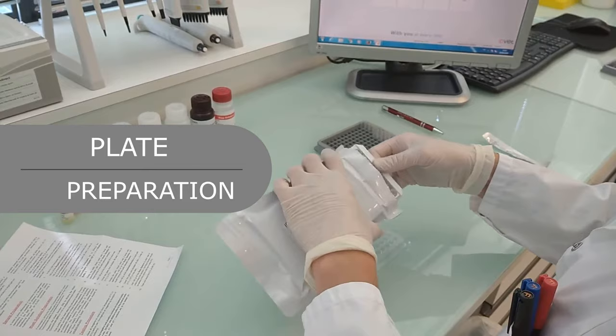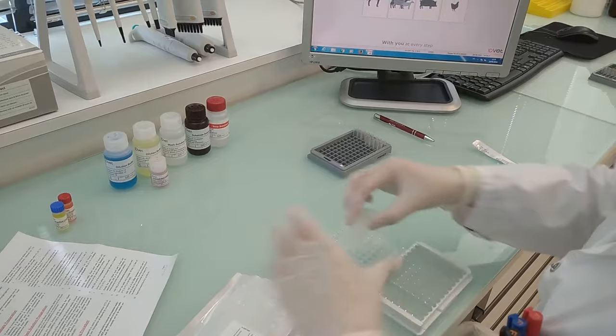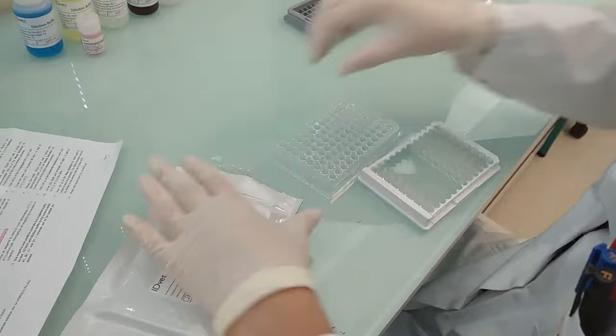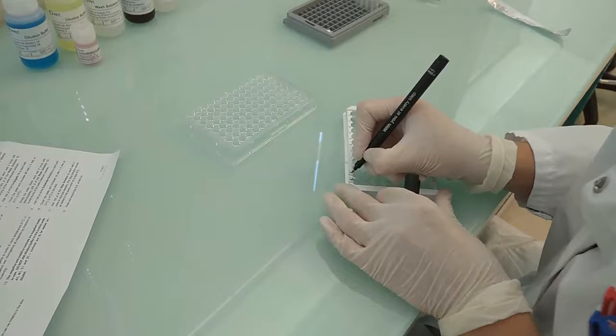Plate preparation: The IDVet ELISA kits can be supplied in whole plate or strip plate formats to suit your testing volumes. In this run, the strip plate format is used. The remaining strips are being kept aside for future tests. Do not forget to identify your strips for good traceability.